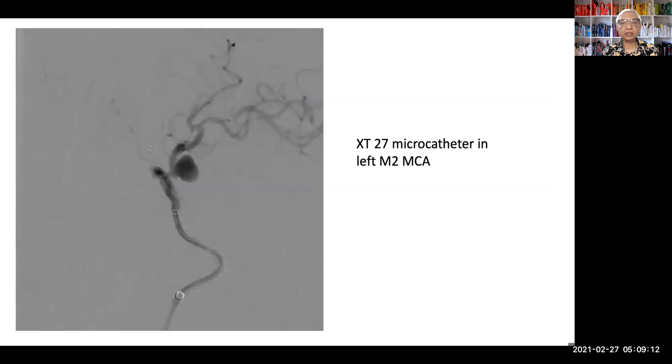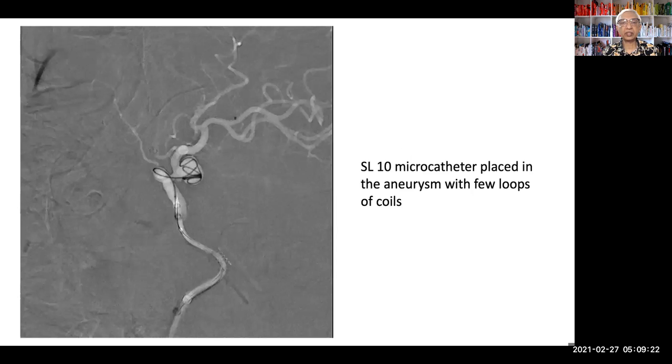We used a 4 millimeter by 30 millimeter flow diverter. It was a little longer than what I would ideally use, but like I said, we wanted to make sure we could do a convenient pull and push. We got an SL10 by the side. You can see the micro on this end, the SL10 this side.